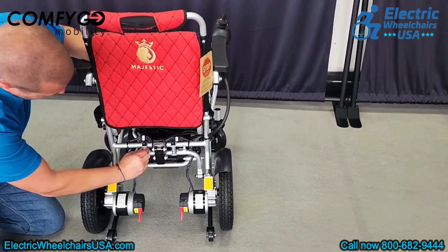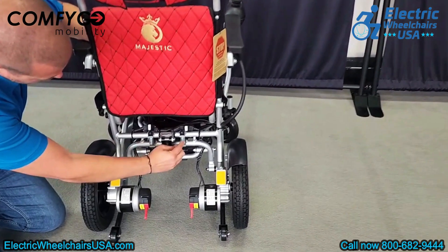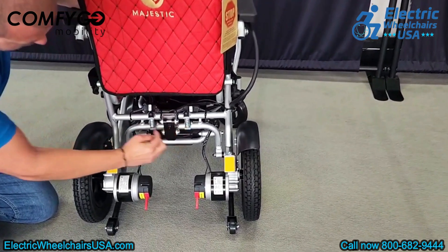At the back, there are two suspension springs designed to absorb shocks when traveling over uneven terrain, ensuring a smoother ride.